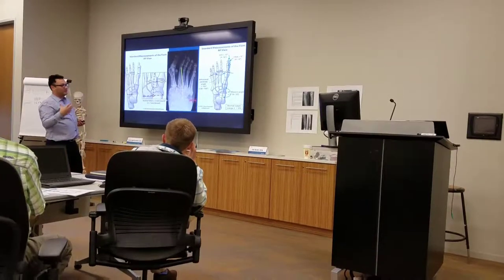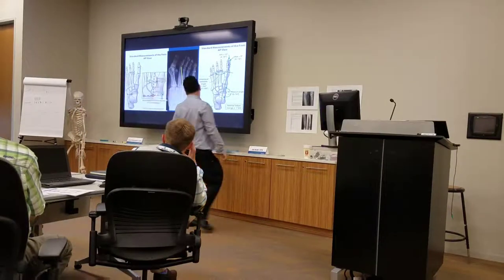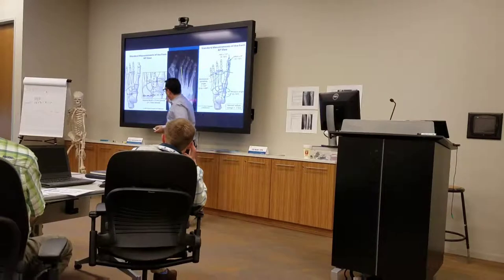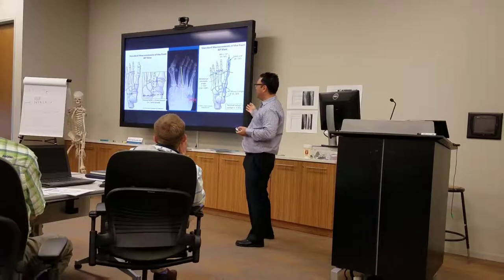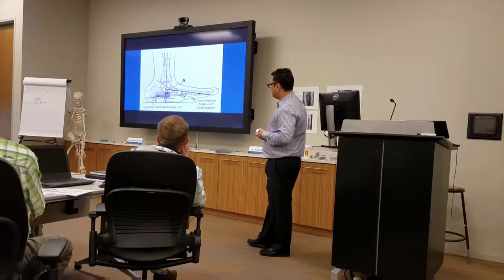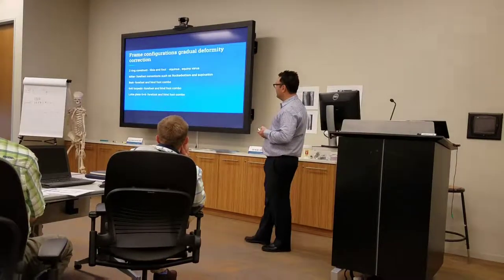So these are the deformities you're trying to look at. Sometimes you look at an x-ray and you go, it doesn't look that bad. You can see that your Charcot patient's navicular is gone. But the patient had pain, it's very hard for them to walk, and they don't have the proper structure of their foot. So here's what your typical lateral Meary's angle looks like in a Charcot break.